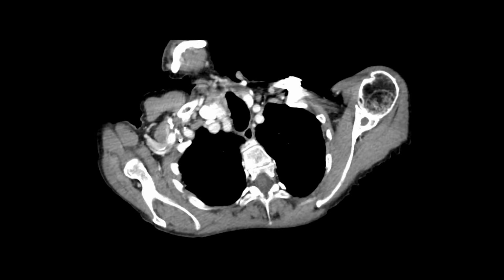So, this was a nice discussion that I had with the technologist I was working with that day, and we were like, well, what kind of timing are we going to do here? And what we decided to do, since a typical chest CT sometimes is scanned at about 30 seconds or 35 seconds, and if you're looking maybe at the arteries in the neck or in the arm, you might be scanning a little bit later. If you're looking at the veins, you got to have time for the contrast to travel out in the arteries, go to the hand, and then come back in the venous structures. And so we kind of just picked 45 and 65 seconds. We did a dual phase scan on this patient to try to get a good study and answer a clinical question.